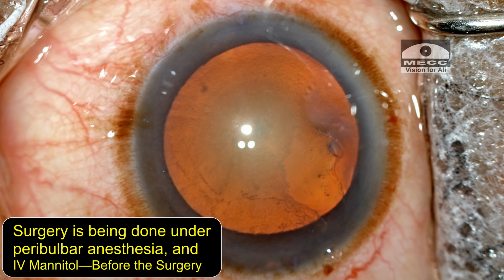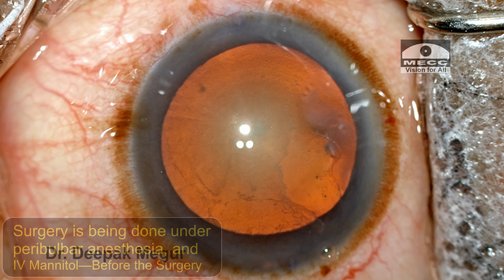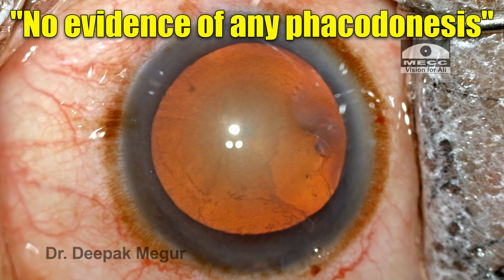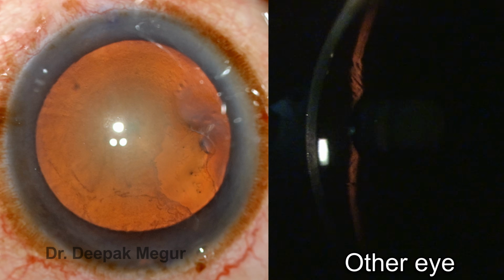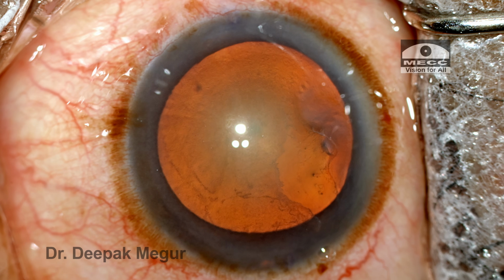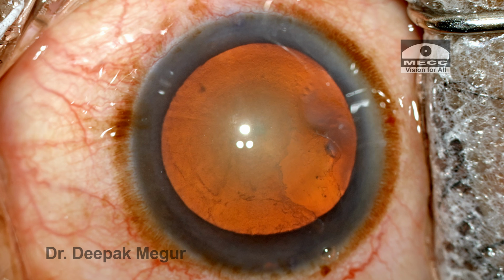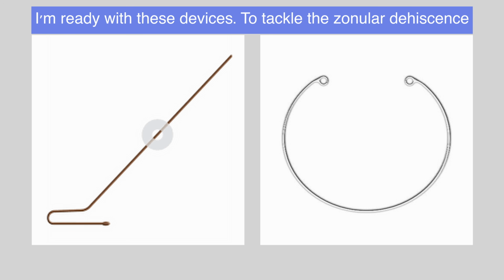The surgery is being done under peribulbar block with IV mannitol having been given. We have a soft eye. So remember that at the slit lamp there is no evidence of phacodonesis suggestive of weak zonules, but at the back of my mind, looking at the other eye picture, it looked to me like the zonules could be compromised, and that's the only reason why the entire lens diaphragm is shifted anteriorly. So I'm going in with all my plans ready in case of a zonular weakness, which if I happen to notice intraoperatively, I have got my capsule hooks ready, the CTR ready, and all the other armamentarium.